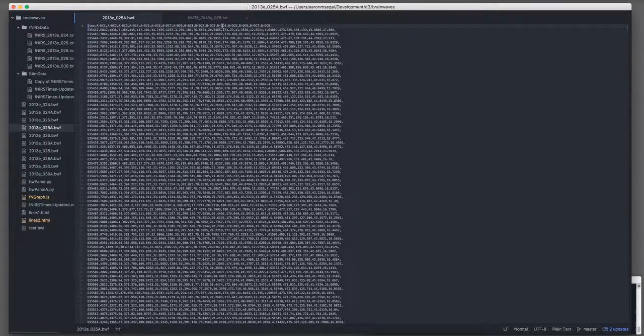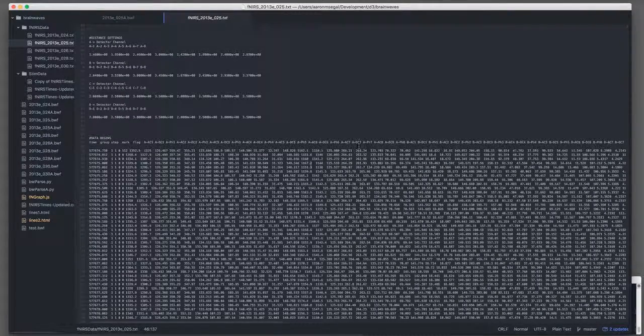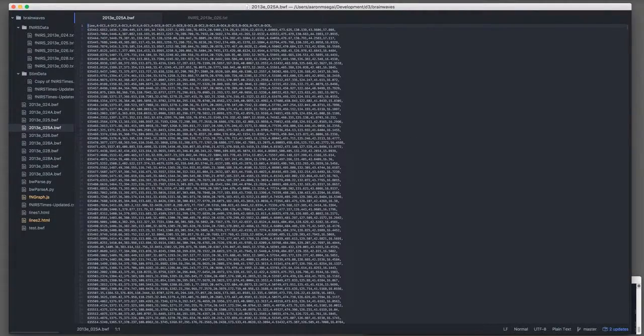So yeah, basically I wrote a Python script that went through this and parsed out the needed information and wrote it to this file here. Another thing you can notice is I actually have two different files parsed, 025 and 025A, and that's because this one's actually still reduced further by averaging every 10 value sets from sensors.